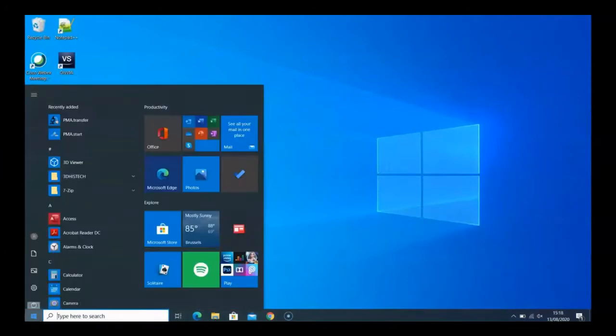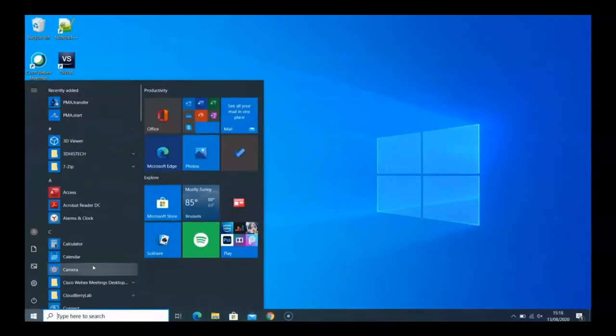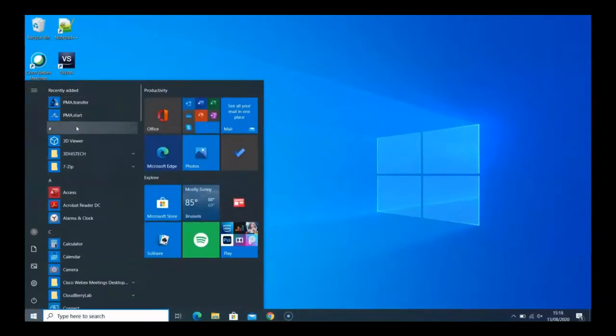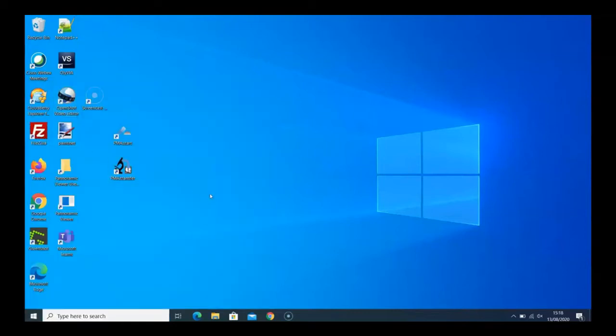After the installation, you'll see PMA Start is integrated in the Start menu. Clicking this takes you directly to the viewer through your web browser.